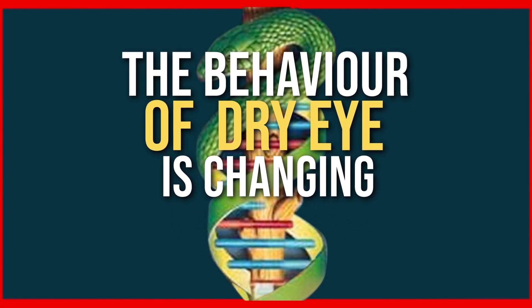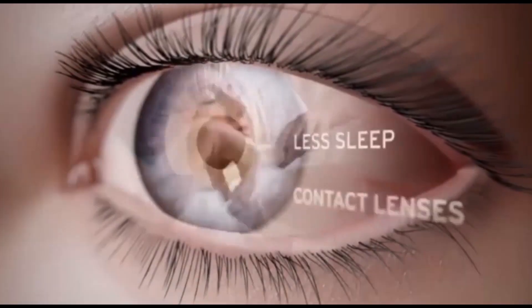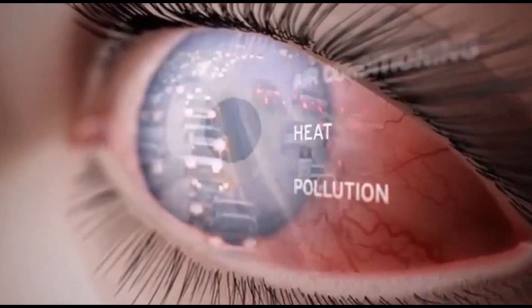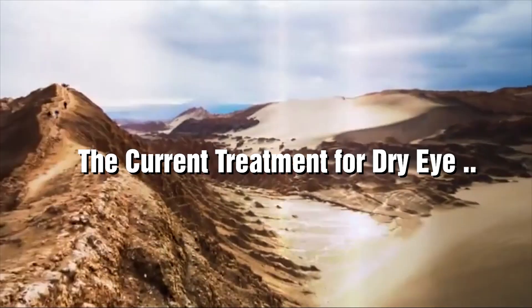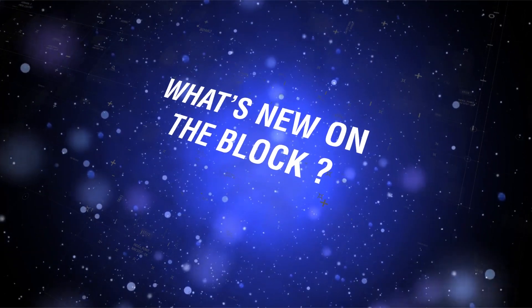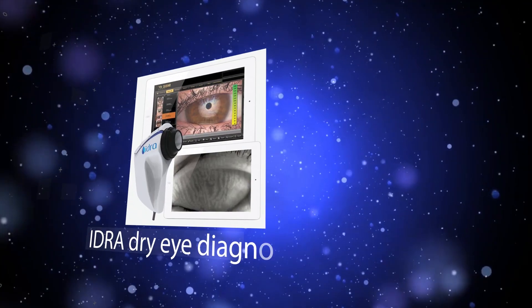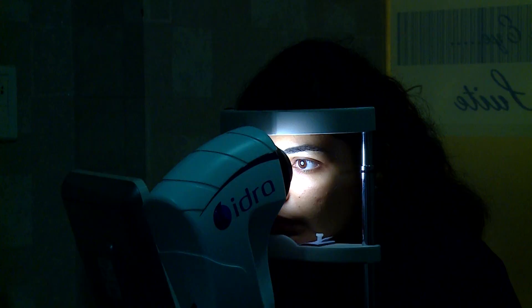Dry eye is a multifactorial disease with ever-increasing prevalence. The current treatment for dry eye is not good enough. What's new on the block? Better treatment needs more advanced diagnostics.